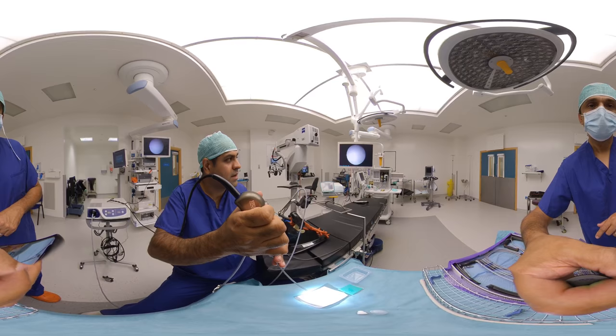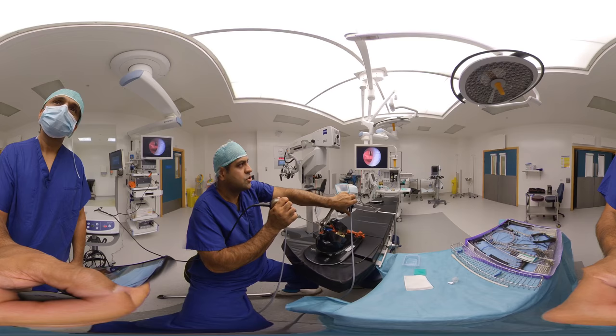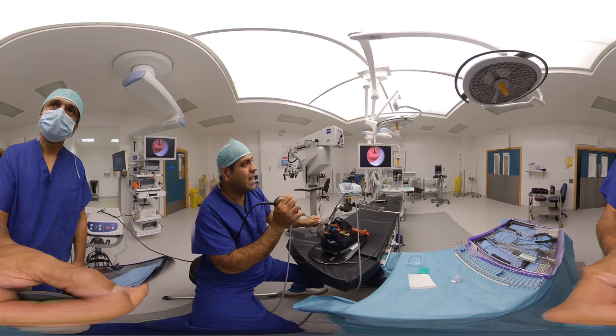Then we can have a view of our larynx. As we go down you can see here — this is a view of our larynx down the end scope. One thing I want you to realise is, if we just change this, as I increase the pressure on there, I can now see the anterior larynx much more easily.